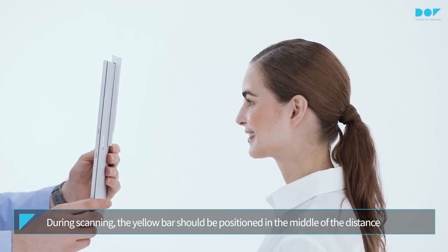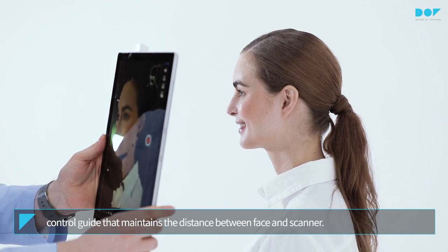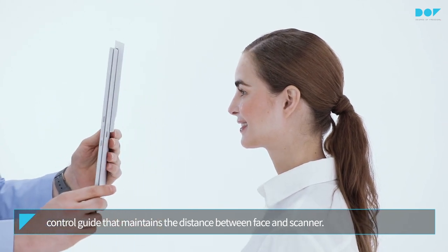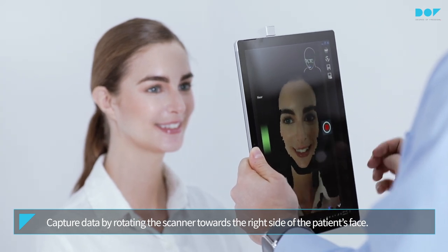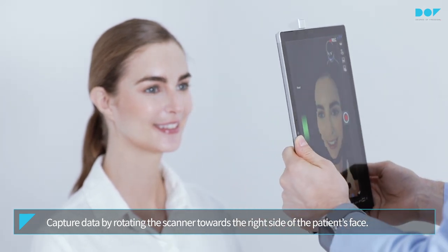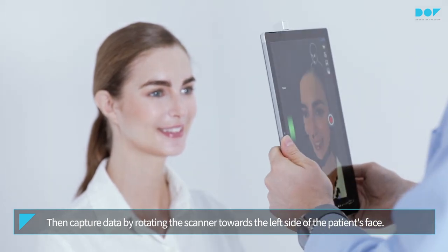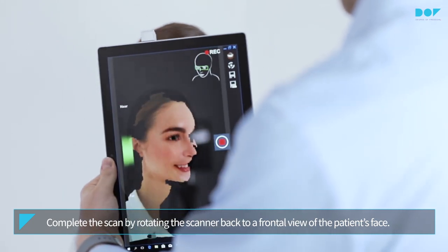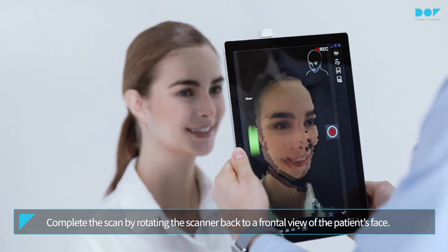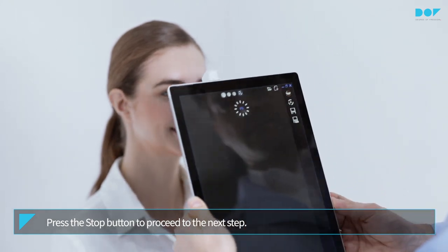During scanning, the yellow bar should be positioned in the middle of the distance control guide that maintains the distance between face and scanner. Capture data by rotating the scanner towards the right side of the patient's face. Then capture data by rotating the scanner towards the left side of the patient's face. Complete the scan by rotating the scanner back to a frontal view of the patient's face. Press the Stop button to proceed to the next step.